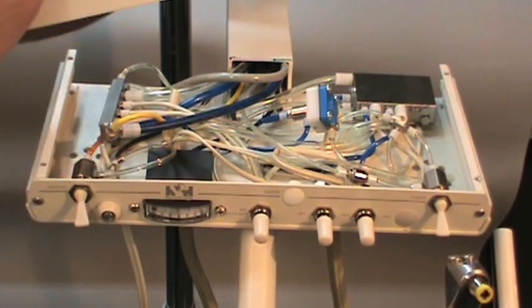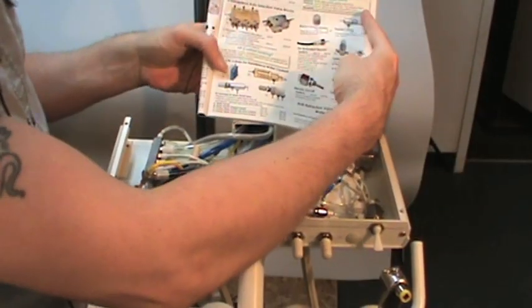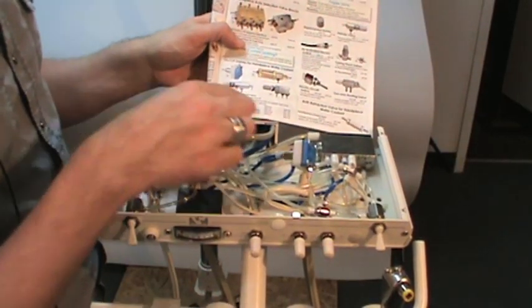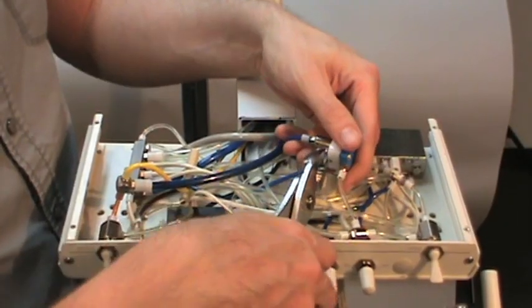We'll be installing a relay valve into this Beaver State unit, and after removing the cover, we want to replace it with a valve that is closest to the original configuration so that we can ensure that it will fit properly.